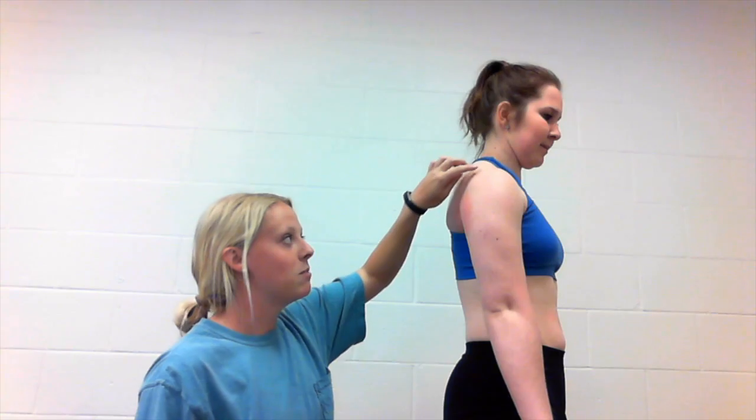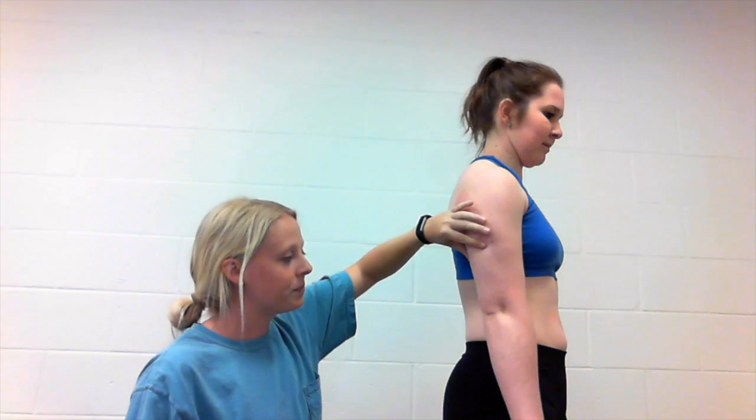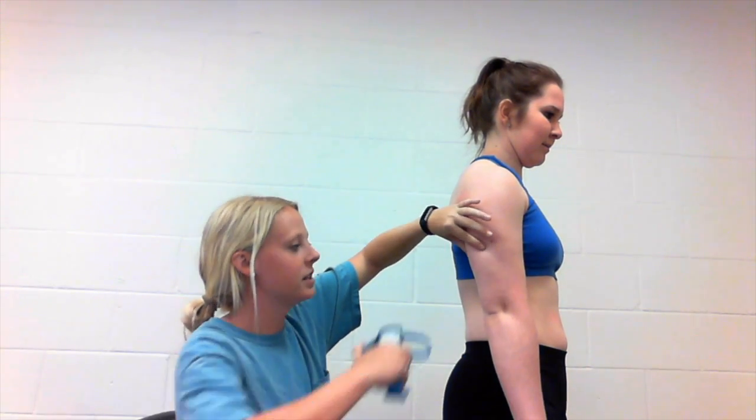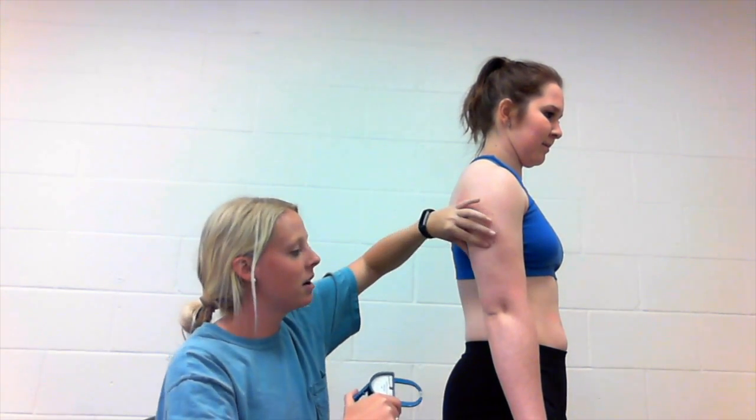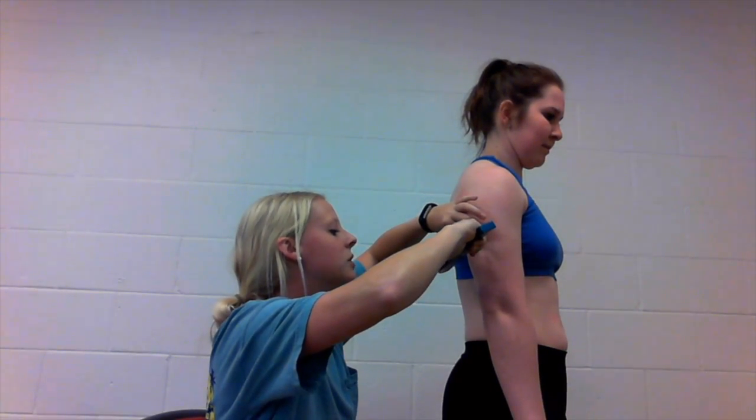With the skinfold assessment you have a three-site and a seven-site option. We'll start with the three-site. Since Holly is female, we use the tricep, super iliac, and thigh sites. For a male participant you would use the chest, abdominal, and thigh sites. For the tricep, I take the midpoint between the acromion process of the shoulder and the elbow, grab the skin with my index finger and thumb, and slowly release the jaws for two seconds.